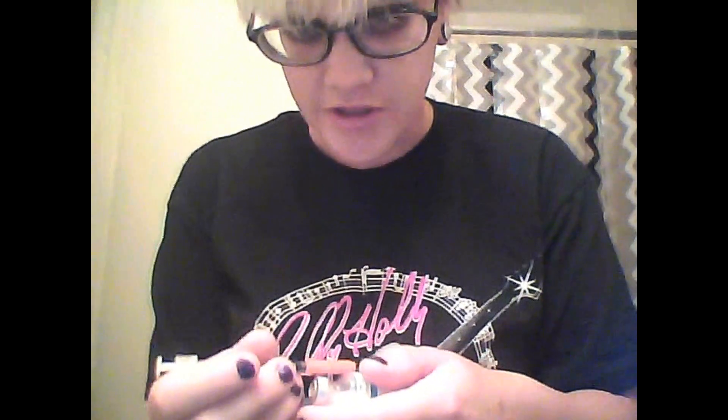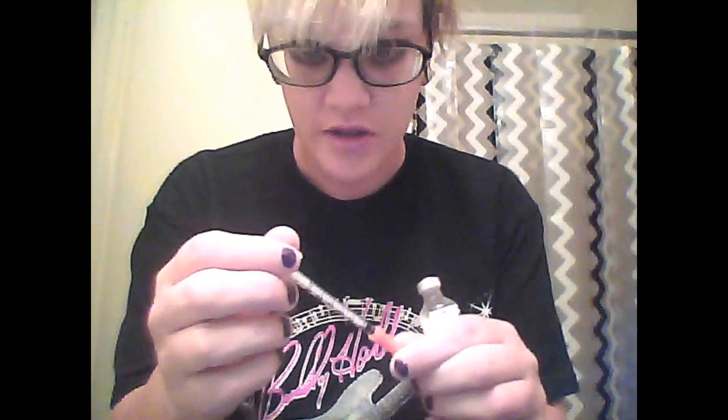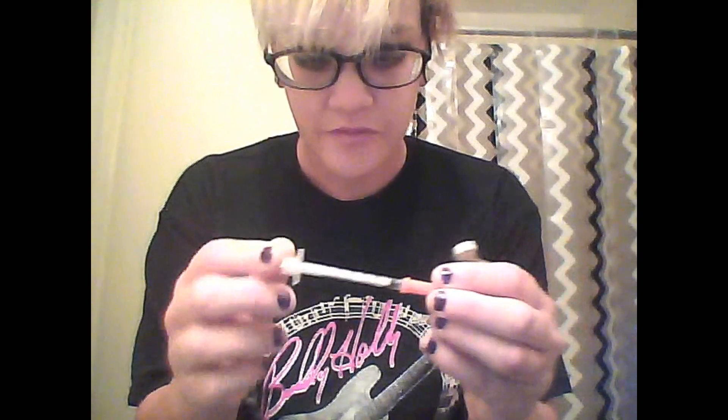Basically, on the top of the insulin there's a little rubber part right here where you can inject the needle to draw up the insulin into the syringe. This little plunger is what you use to draw the insulin out and push it back in, and there's a little cap on it. You take the cap off — that's how big the needle is. It's not really that big. It looks bigger on camera than it does in real life, but it's not big at all. It doesn't hurt.